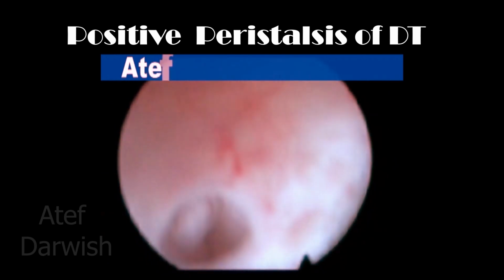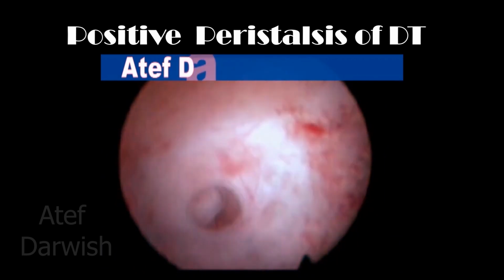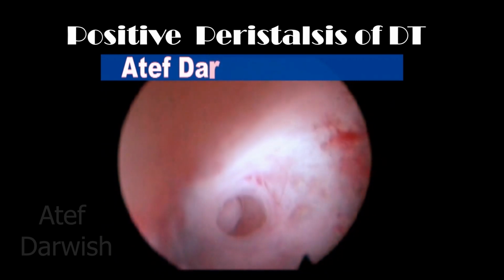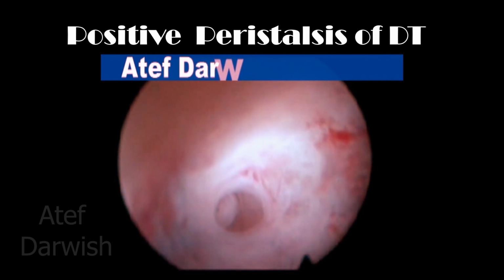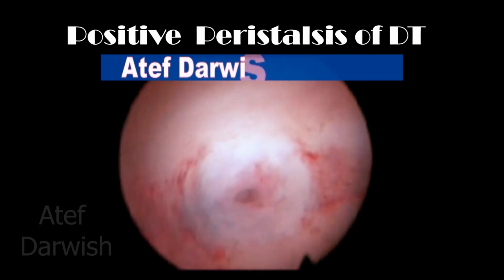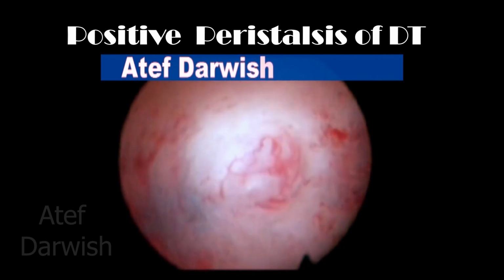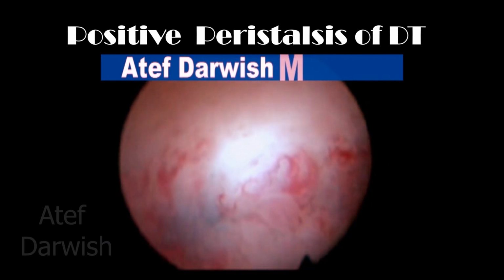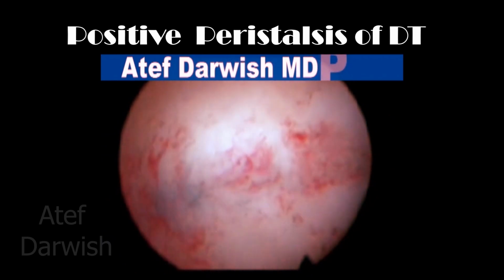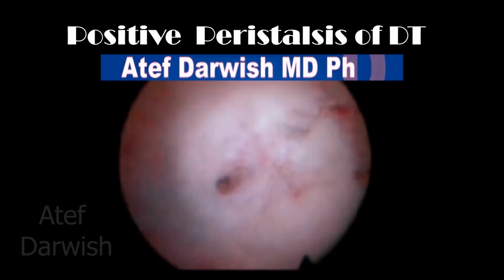So if we combine positive peristalsis, which is a test of the physiology of the proximal part of the fallopian tube, and a positive bubble flow test, which is a test of the anatomy of the proximal part, this is called the Darwish hysteroscopic patency test, which means that the proximal part is anatomically good and physiologically good. So the proximal part has a good function for the ascent of sperms to fertilize the oocyte in the ampulla.